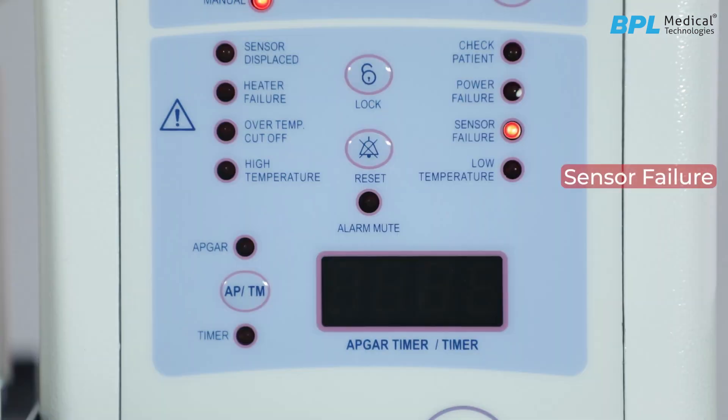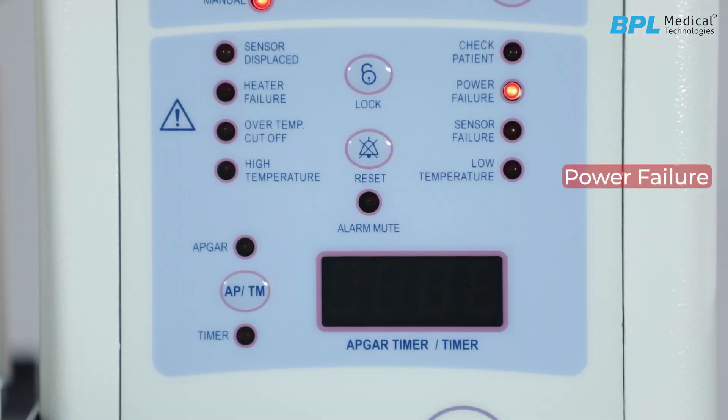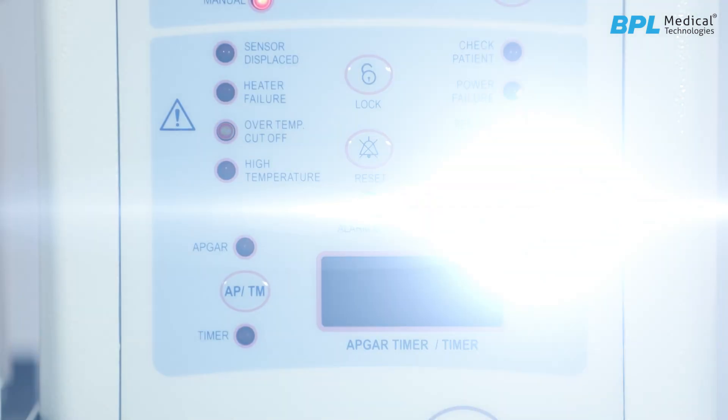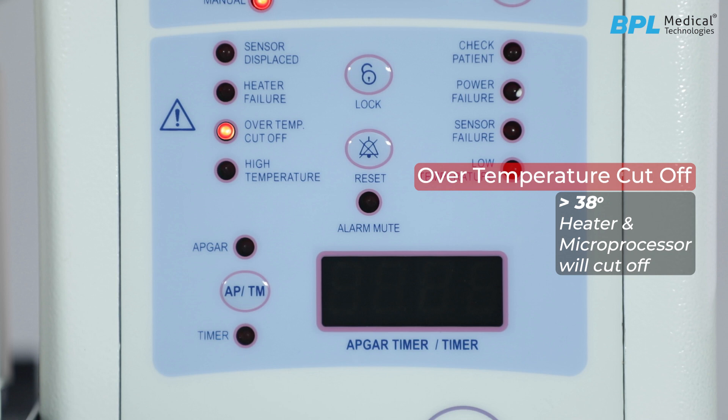Sensor failure alarm: this activates if there is any defect in the temperature sensor probe. Power failure alarm is triggered when there is any power failure. Over-temperature cutoff activates when the baby's temperature exceeds 38 degrees Celsius. Whenever the machine indicates a high temperature cutoff alarm, the unit will shut down as a safety precaution. You will need to manually switch off and switch on the main power to restart the unit.